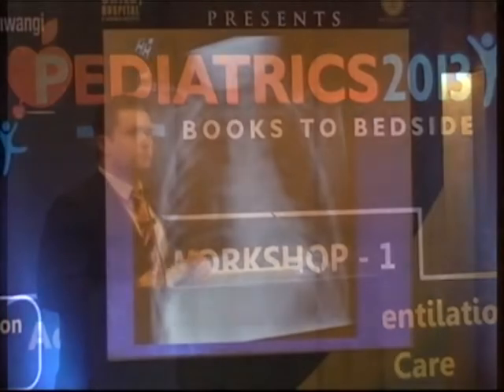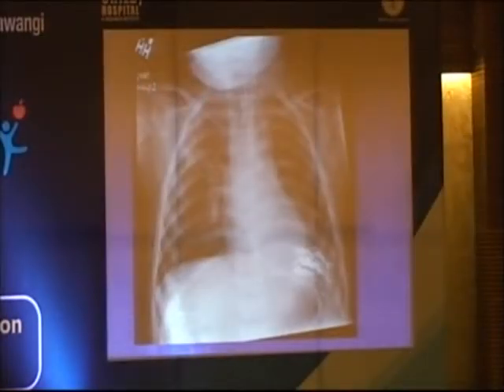All right, so if you want to just go back two slides to look at the chest X-ray again. The other thing that's notable about this chest X-ray is that he's pretty hyperexpanded. The tidal volume on this patient was 11 mLs per kilogram. And I would say the cardiac silhouette's a little on the small side.